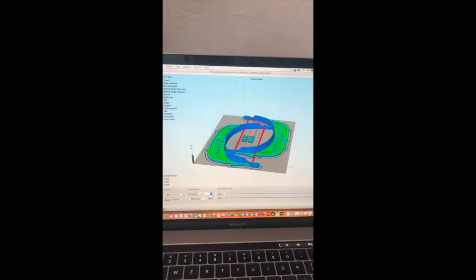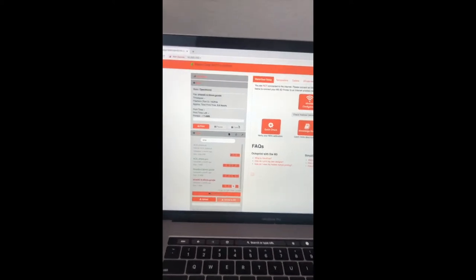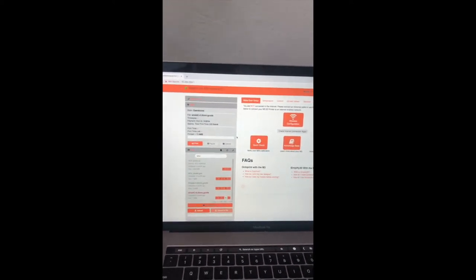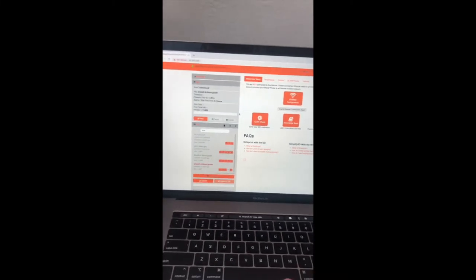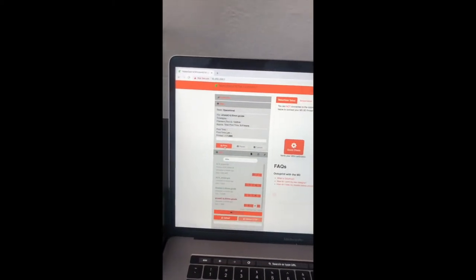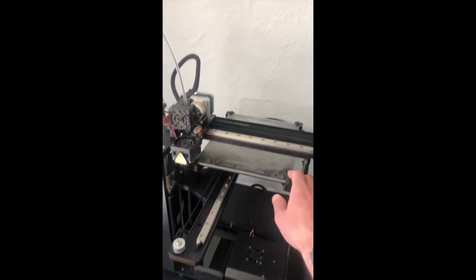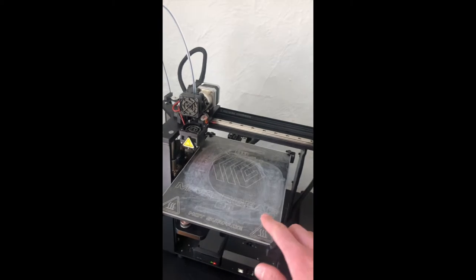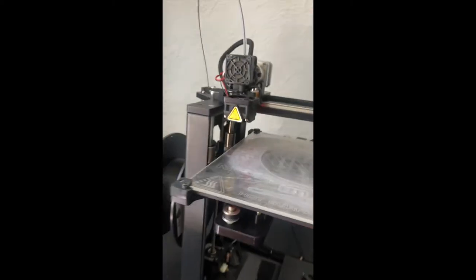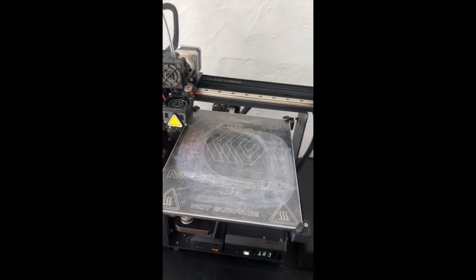Now, I've uploaded that file to the control interface for my 3D printer. What you see here is essentially the main dashboard for telling this little machine what to do. I've chosen the file and I press print. The machine will sing me a little song to let me know that it heard my command. And now the heated build plate here will heat up, as well as the extruder, before the printing process commences. As soon as it's hot enough, the printing process will get started.